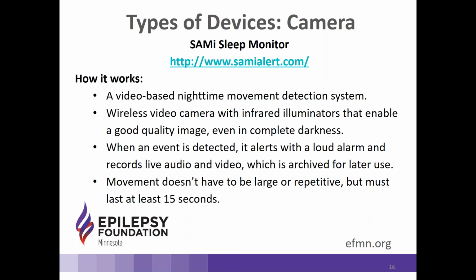This device does have a bright white power light, and you can cover that up. But it also has a ring of red lights that can't be covered. So that's something to think about when you're thinking about whether this is a good device for you, because some people may find that comforting, kind of like a night light, but if you or your child would be bothered by it and wouldn't be able to sleep, then it's not going to be a good choice for you. And again, that's just one example of the types of things to consider when you're choosing a device. We'll be talking more about other things to consider later in the webinar.